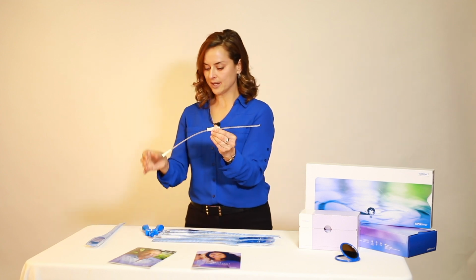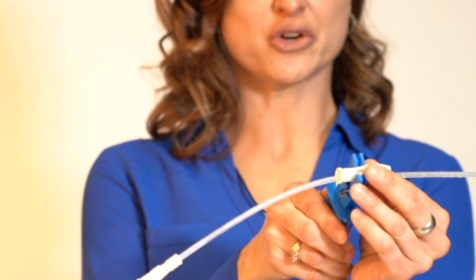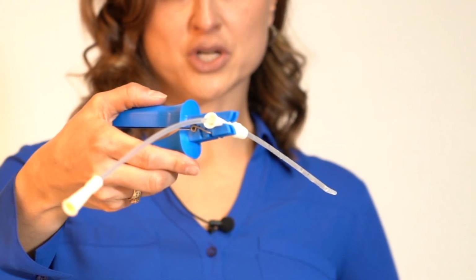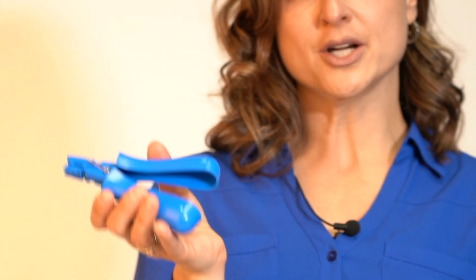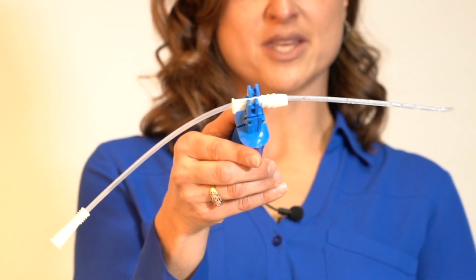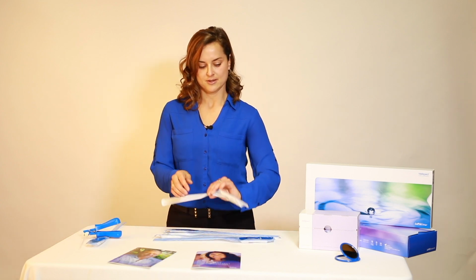And for end users having some difficulty handling the LoFric Origo with only the insertion grip, they can add the LoFric Easy Grip handle right on top of the insertion grip. This is something that can be washed with soap and water, and then you would just squeeze it and apply it right on top of the insertion grip. Okay, so that is one method.